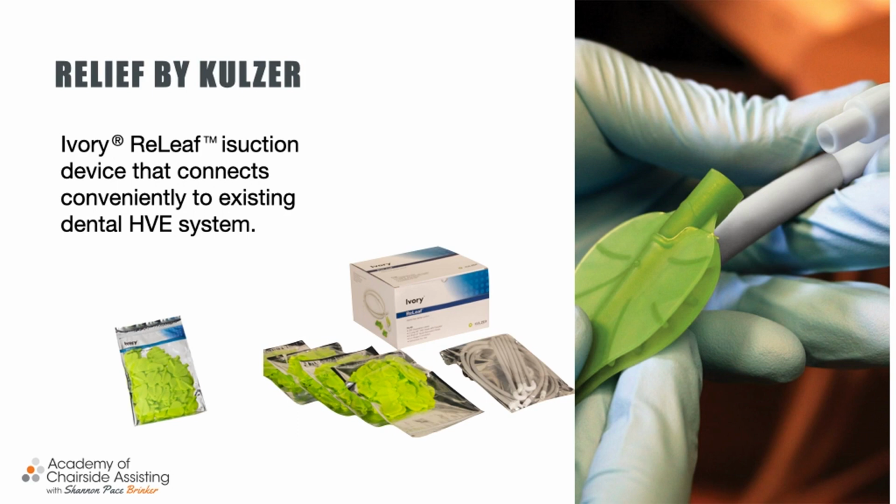And these are reasons why we utilize a lot of these devices as well, to help with the saliva pool, but most importantly, helping those patients, if they're coughing, to not interrupt procedure time, and controlling the aerosols, right? But before we had COVID, that was the main concern for us: every time the patient would cough, we'd have to stop, or sit them up, or give them some water. So those interruptions of procedures is a huge plus now with all of these devices.